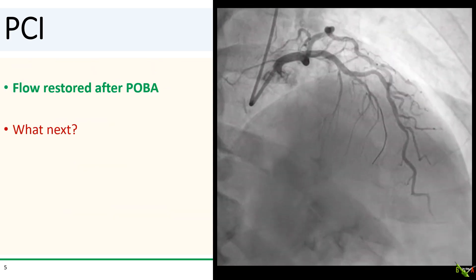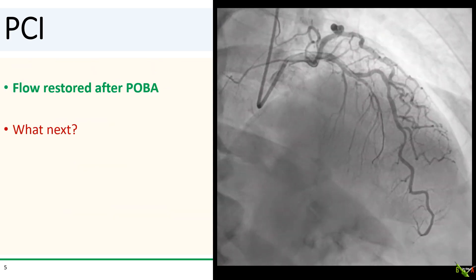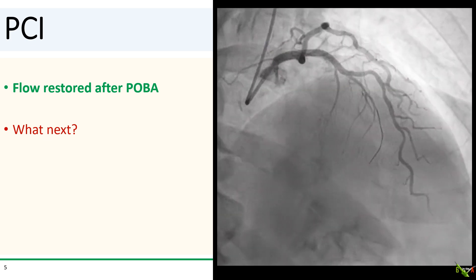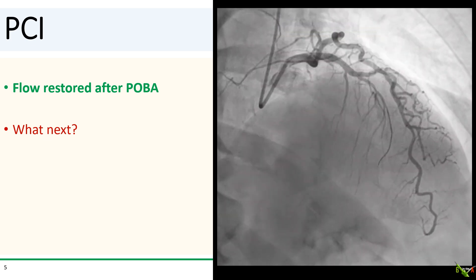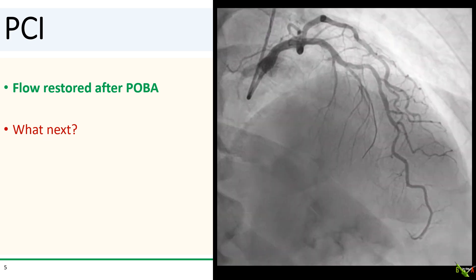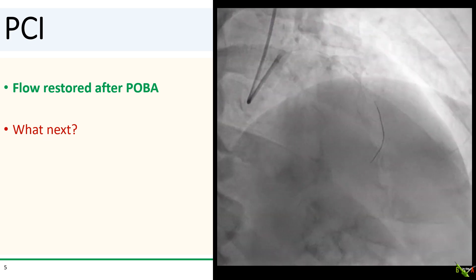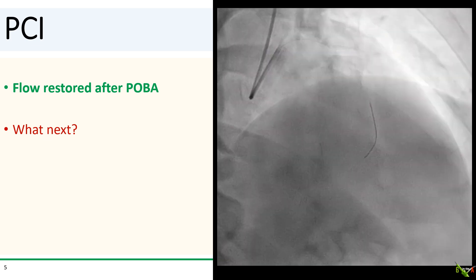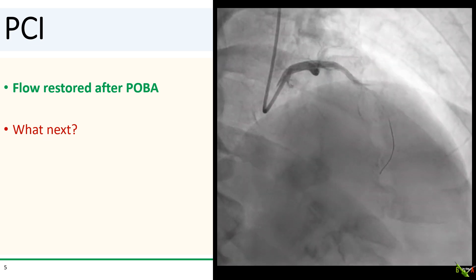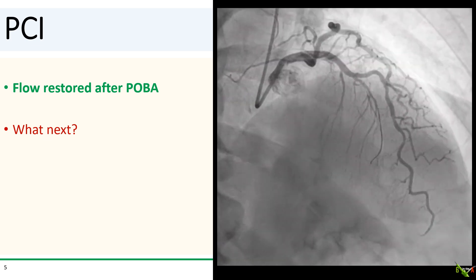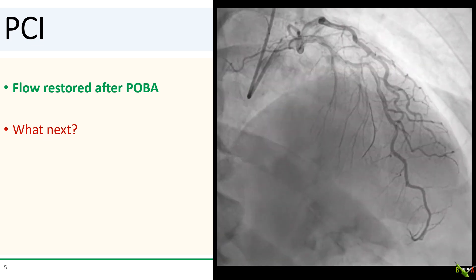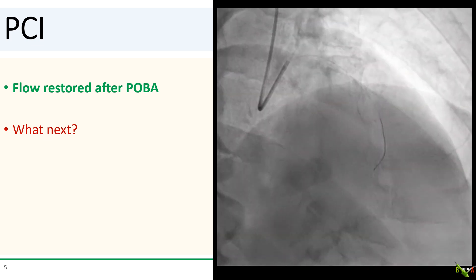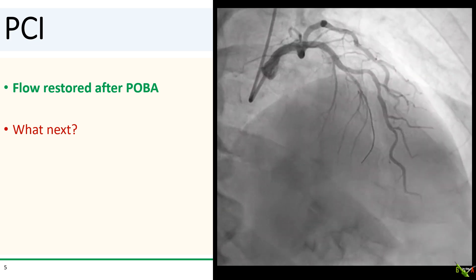Here is what we have after POBA. The patient's chest pain resolved instantly, and the culprit was indeed just a septal — it was not a twin LAD. So what next? I don't see a clear dissection, but should we stent it anyway?